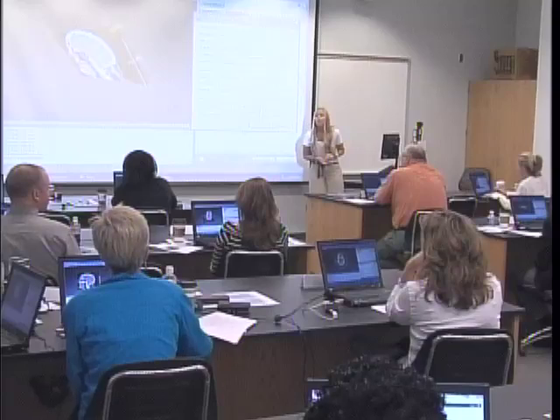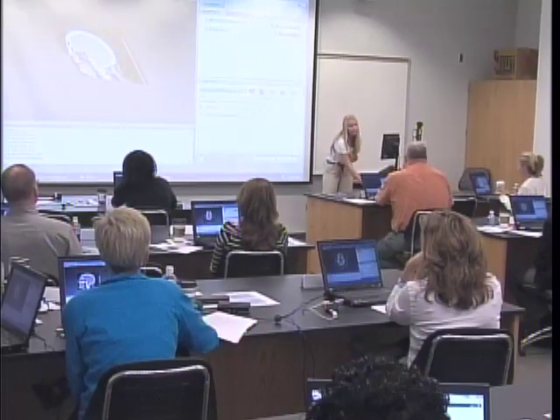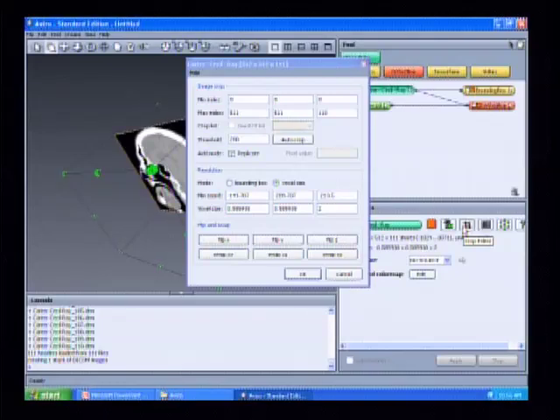Excuse me, could you just go over where the crop tool is again? Sure. If you go back up into the pool and click on the green, your main data set, to make sure that it's selected, this properties area will light up. Oh, I see, and then the crop tool is below. Right. So in the properties area, you can just click on that.